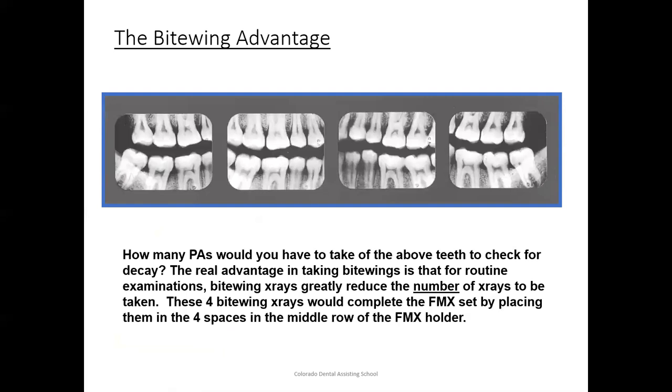You don't want to stop taking your FMX. Please go ahead and finish the FMX, because in the panoramic x-ray, it's really hard to see up close to the films that we get from the FMX. So you don't want to trade one for the other necessarily, but you might need that film extra.